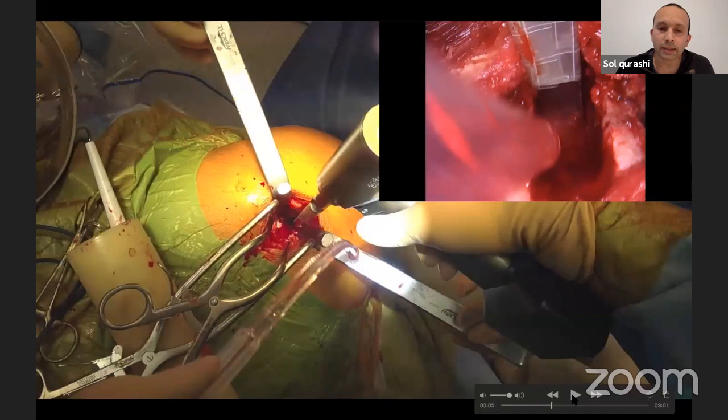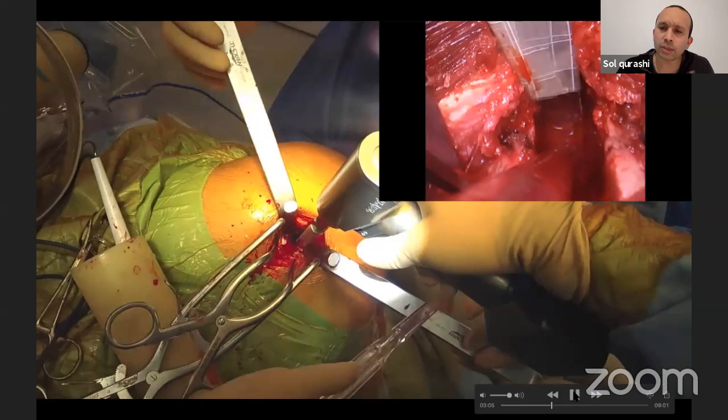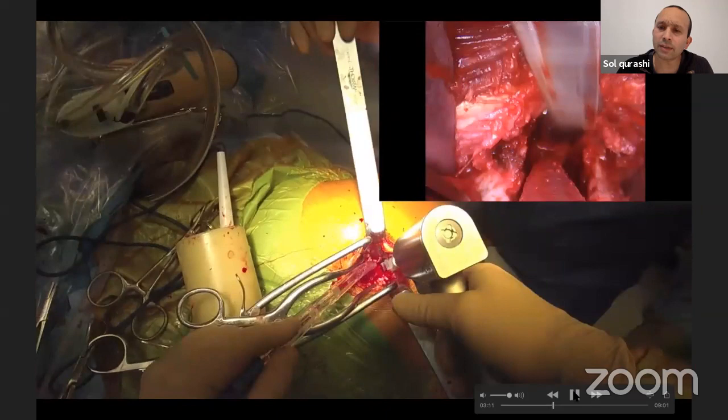And you may notice this is a recip saw, but I put a bit of Comfield tape around there. The blade goes all the way top to bottom. So I put that tape around there so it doesn't damage the back of medius or minimus or piriformis. So I put the saw in front of the broach, like so. Usually put a sucker in front of it so I can see. And I cut the back, front, and then the saw just sort of slides in medially as well.